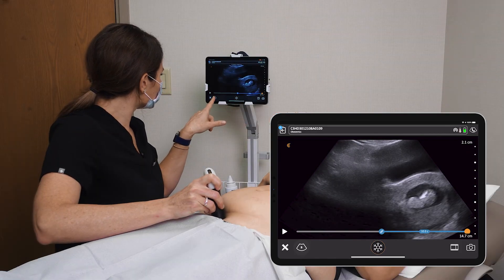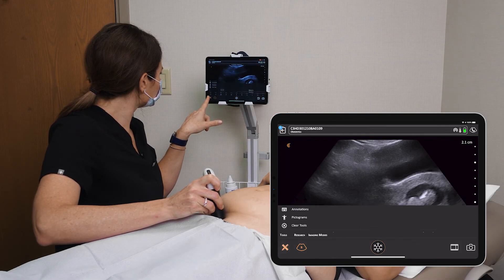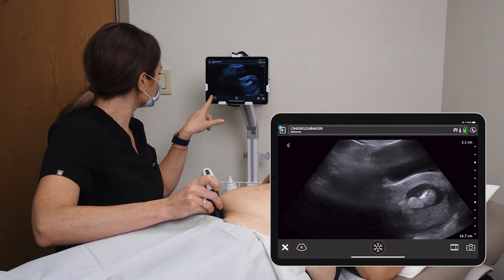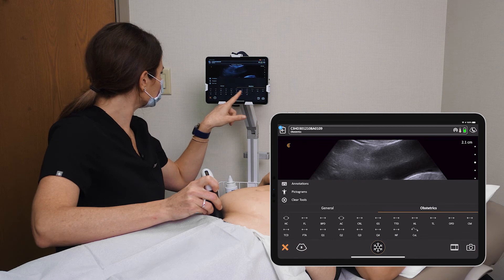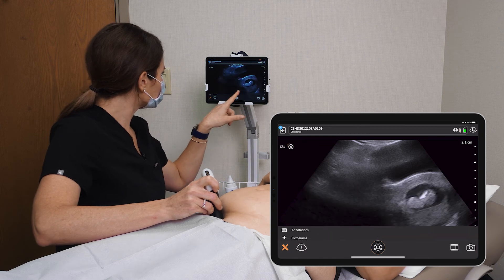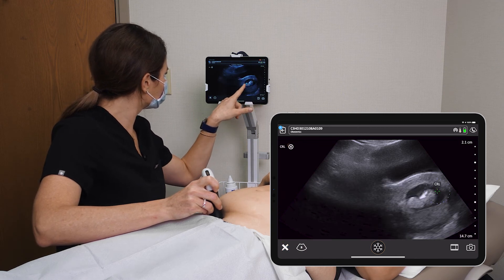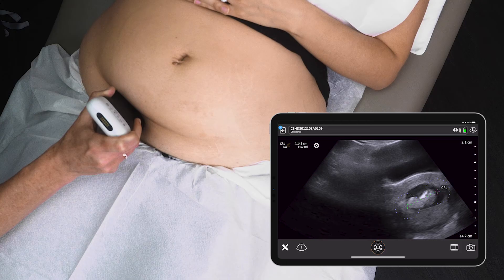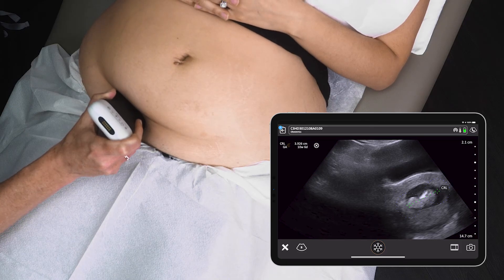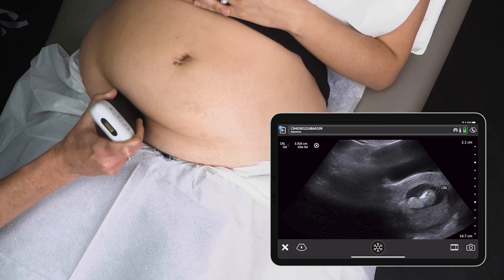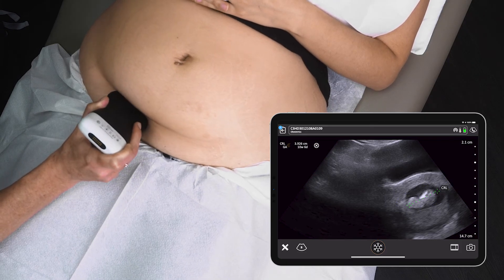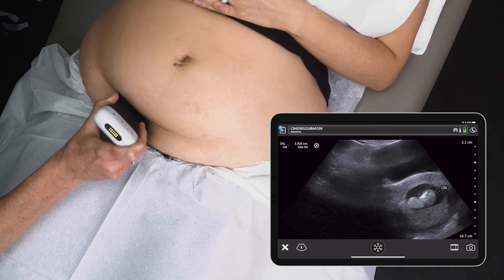We can go to tools and measure the crown rump length. We're getting about 10 weeks and 6 days, which is consistent with the last menstrual period.